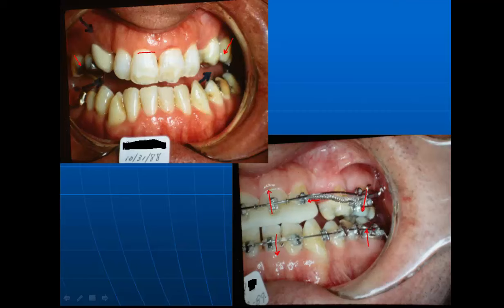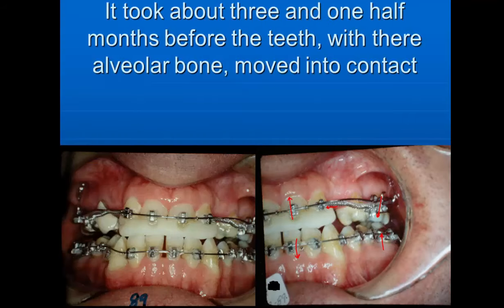Now, once we get it expanded, get the upper teeth over in the proper relation with the lower teeth and the anterior out, okay, then I checked this and we've got it out there now where we really want it to be, and so it's time to take this block off the anterior part. We'd have to cut down in between, and you can weaken it, and you squeeze them together with pliers. They come off pretty easy. You don't want anything that sticks really tight.